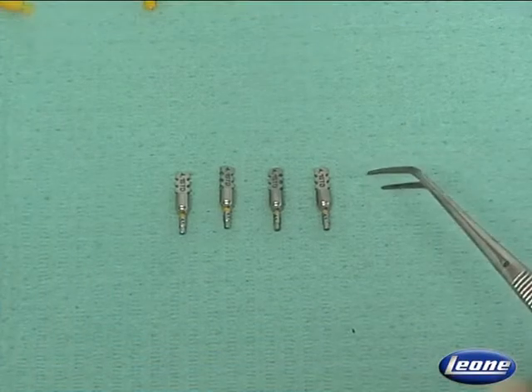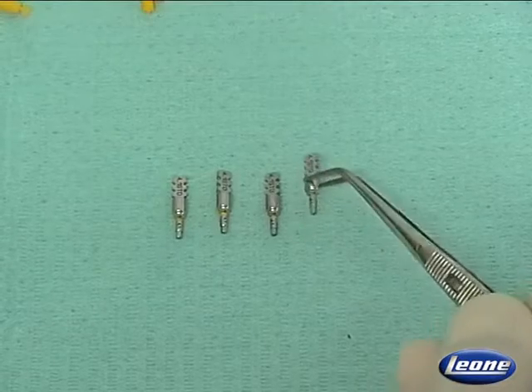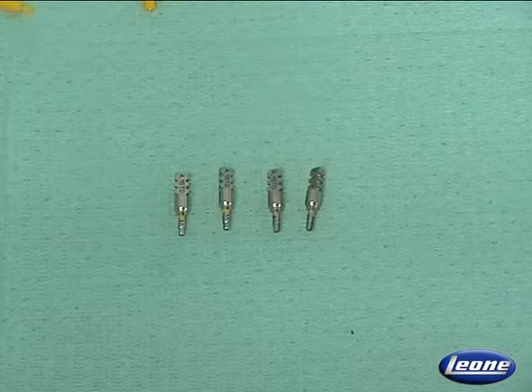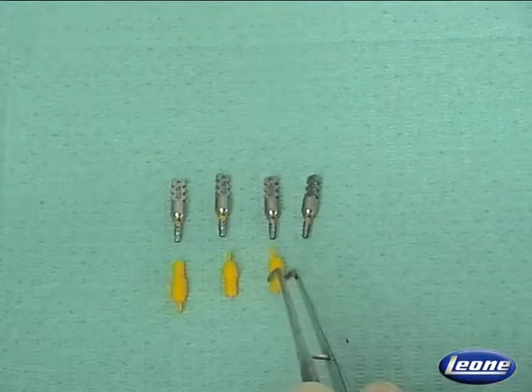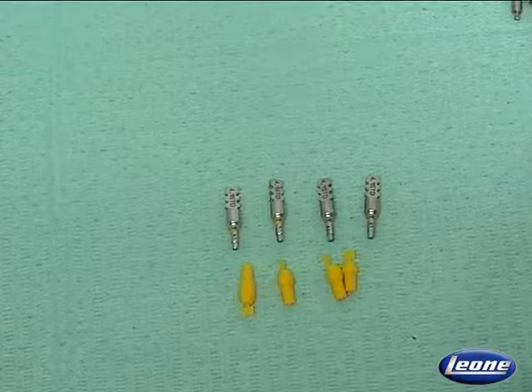Two weeks ago, I took an impression with these 4 standard transfers, acquiring the position of the 4 osseointegrated implants. My technician has poured up a dental cast in order to choose the appropriate abutments with the help of these try-in abutments.